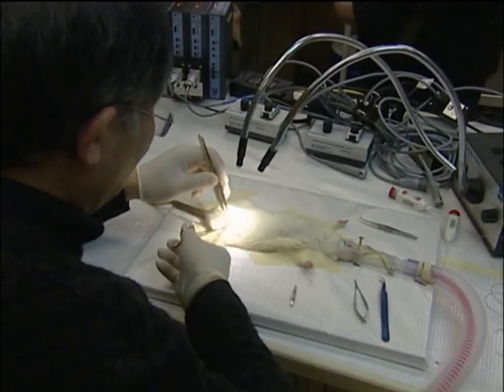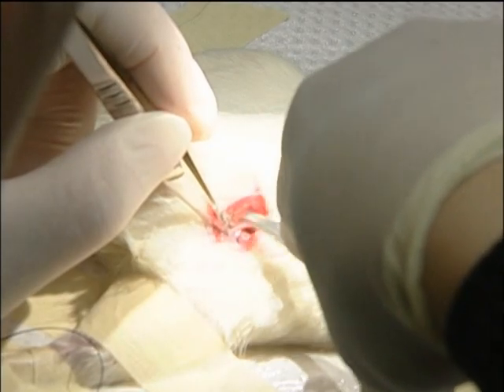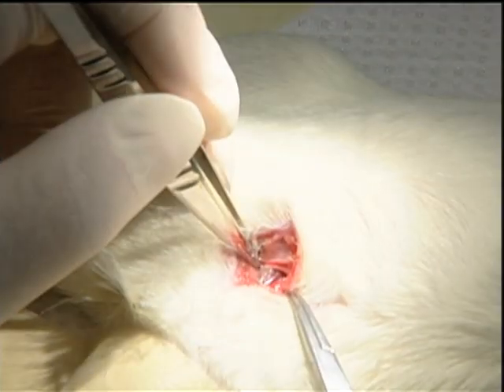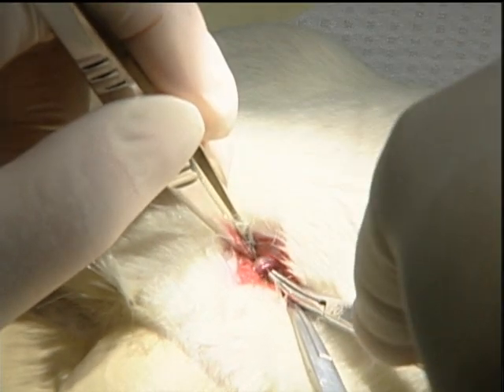Now that you are familiar with the equipment, let us begin. The anesthetized rat is secured, and after locating the femoral artery in the leg, a small nick is made on the skin of the upper thigh. Note the artery flanked by the femoral nerve and vein on either side.